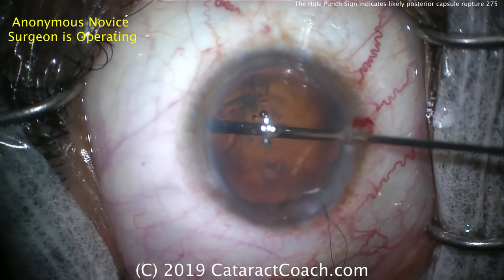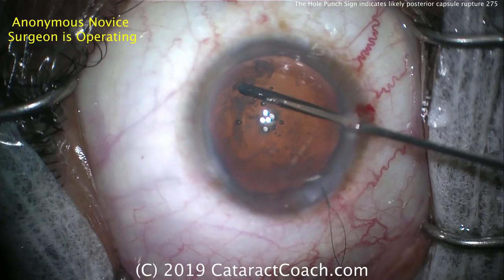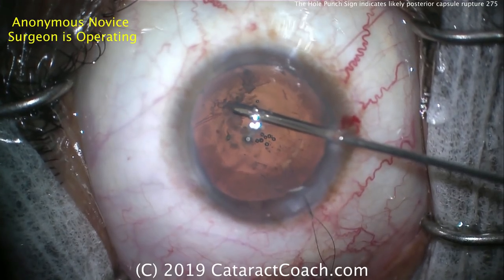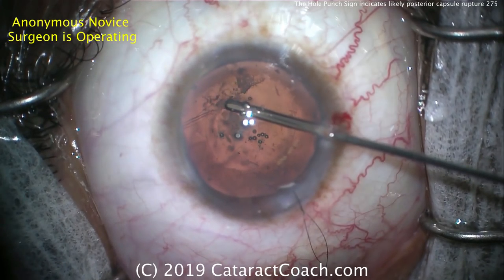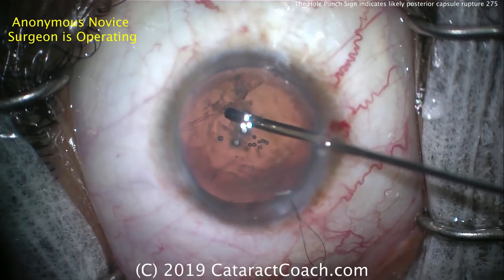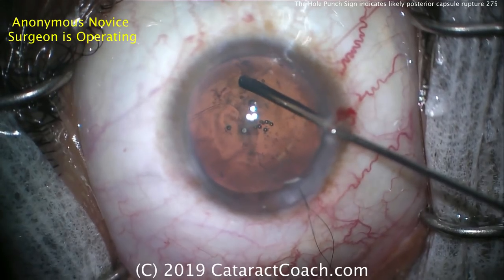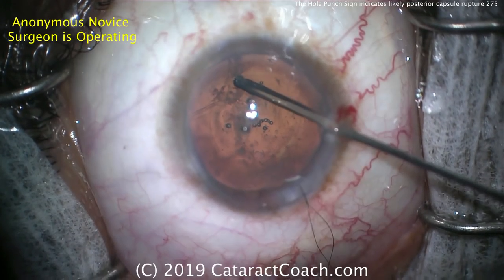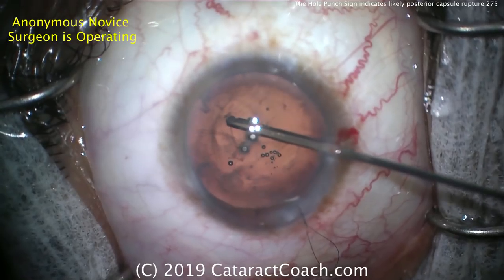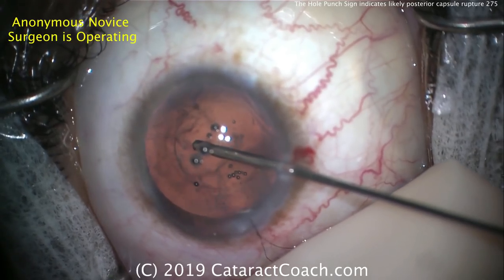Cleaning up and removing remaining lens material — you can also get out most of the viscoelastic. Importantly, we need to get out any prolapsed vitreous, so being very careful in the area where we know we have the opening in the posterior capsule. A pars plana approach is advantageous here because it pulls any prolapsed vitreous back into the vitreous cavity posteriorly. When we come from above in this limbal approach, we're actually drawing any prolapsed vitreous more anteriorly.